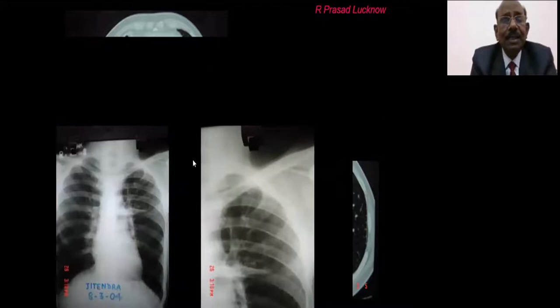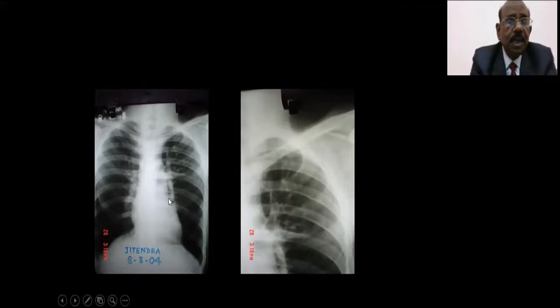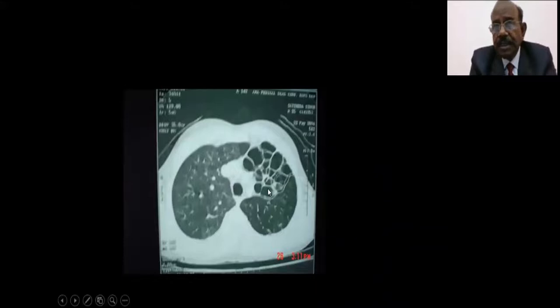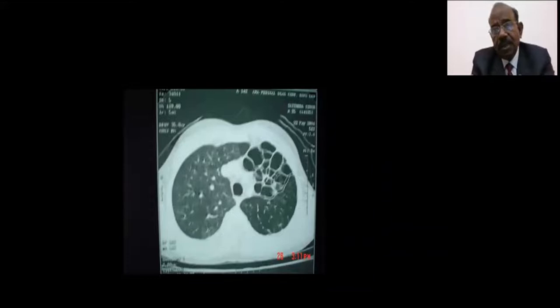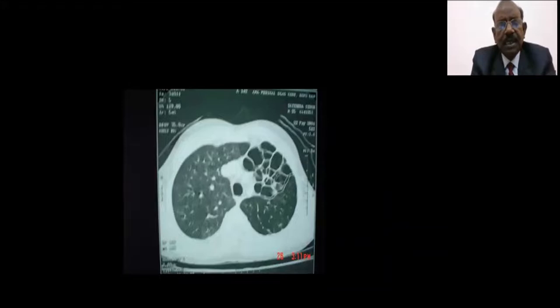In this case, although the X-ray shows some cystic spaces, the CT scan shows this is the upper lobe. As I said, site-wise the most common is lower lobes, middle lobe and lingula is the next, and upper lobe is a rare site — but rare does not mean you will never see it. Most post-tubercular bronchiectasis — bronchiectasis sicca — is usually confined to the upper lobes.